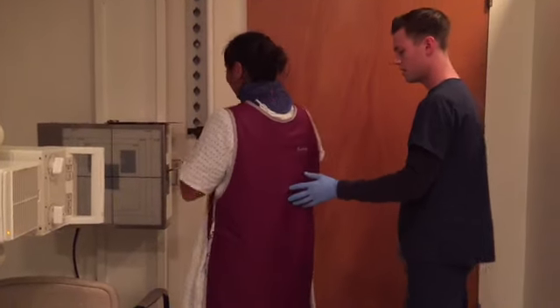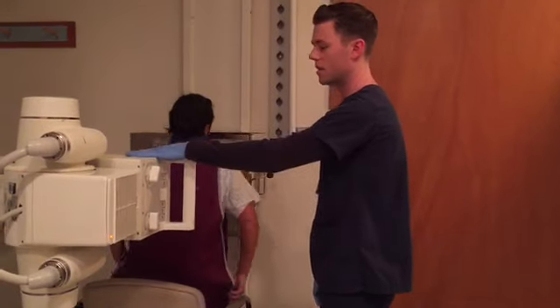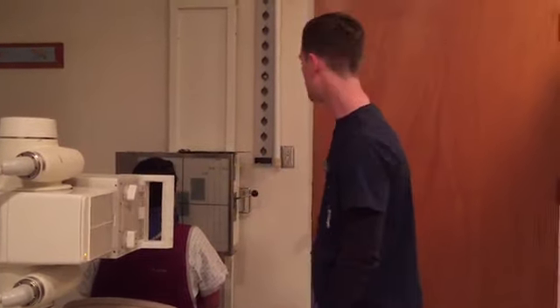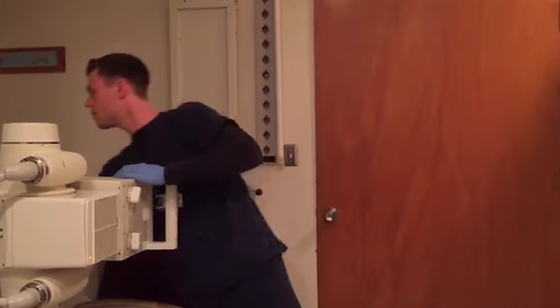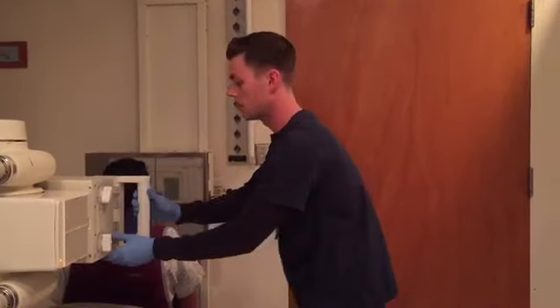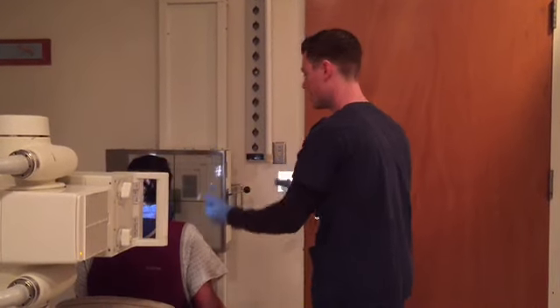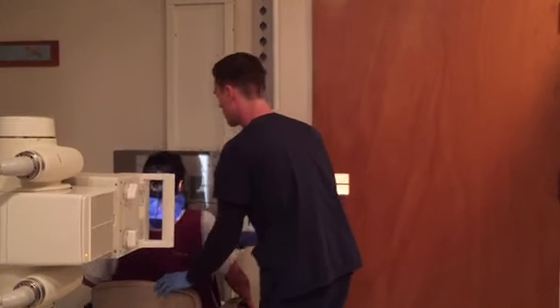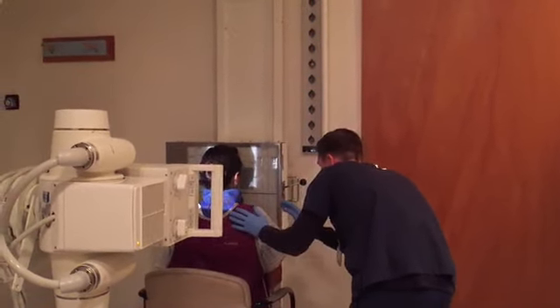Perfect. So go ahead and take a seat. I'm going to be using a horizontal beam for these because we're looking at the air fluid levels in the sinuses and we don't want them to be distorted. So, for this one, we're going to have the mid-sagittal plane perpendicular. So we're going to have her scoot a little bit closer to the bucky. We don't want too much OID. Go ahead and place your face as close to the board as you can get.